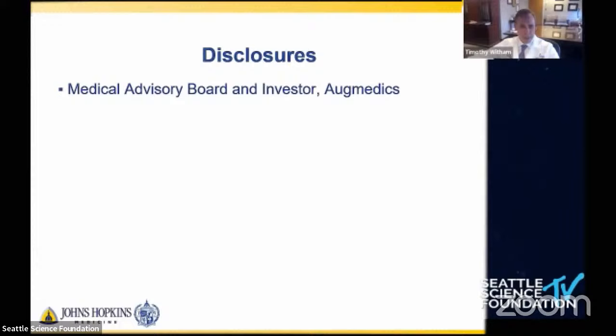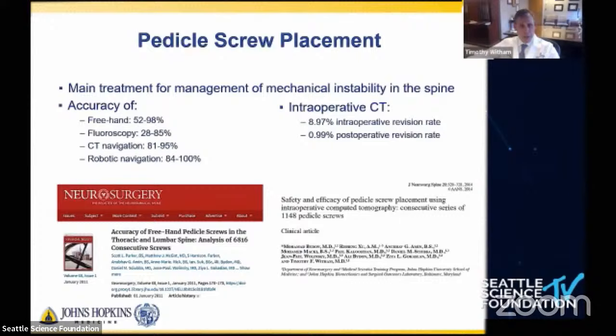Now, there are a number of different ways to place spinal instrumentation, and basically the best way to do it is the way that works best in your hands. Additionally, I would say that there is no technique that we have available that is 100% accurate in placing spinal instrumentation.